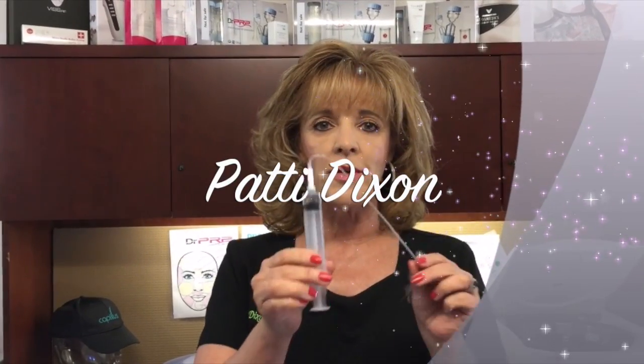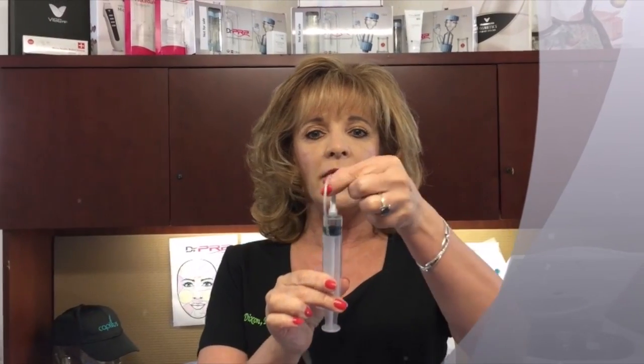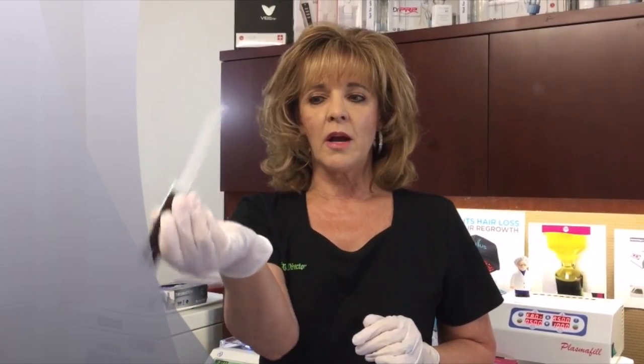The first thing you're going to want to do is load a 20cc syringe with your anticoagulant ACDA. Then you want to prime the needle until the ACD gets right to the tip of the needle. When your blood is loaded into the syringe with your anticoagulant, be sure you tilt it up and down a couple of times to evenly mix the two.